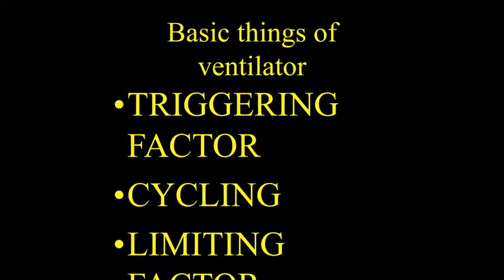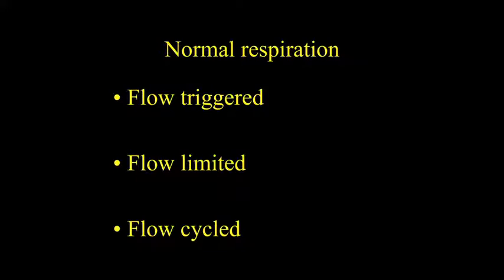My next slide is the answer. So a normal respiration is flow triggered. That means flow triggers the ventilation, flow limited, flow cycled. Like if you cry, go on crying, after some time you have to suck in.